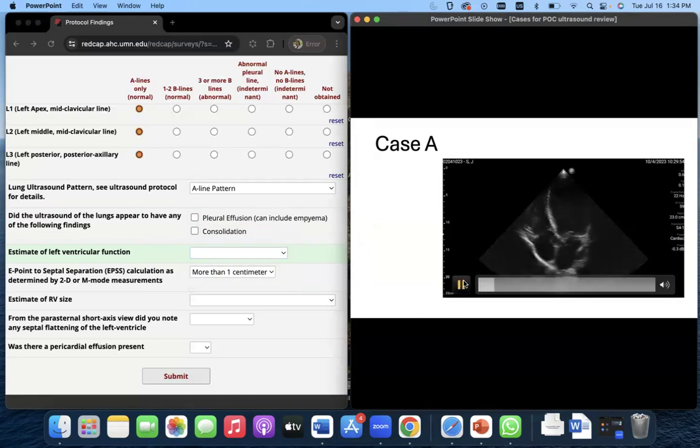This is getting an apical 4 chamber. The apical 4 chamber is often the most difficult view to obtain and can require some patience, but it is primarily useful in assessing the left ventricle and right ventricle next to each other, and seeing whether there is a size discrepancy that we wouldn't expect. In this case, the right ventricle appears to be appropriately smaller than the left ventricle.